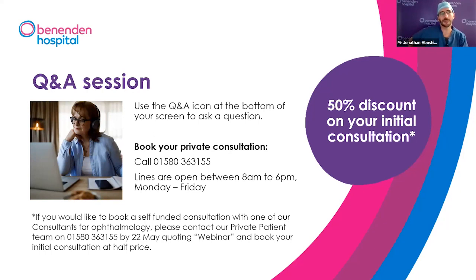So laser eye surgery is increasingly common, and one of the things it does is we have to use mathematical formulae to predict where your focus will be after the cataract surgery, and that's how we decide what power of lens. So you put all these parameters into the machine, say the length of your eye, the curvature of your cornea, the depth of the front of the eye, the thickness of the lens, lots of different things, and they all go into lots of different mathematical formulae, and then we work out what's the most likely lens to give you focus where you want.